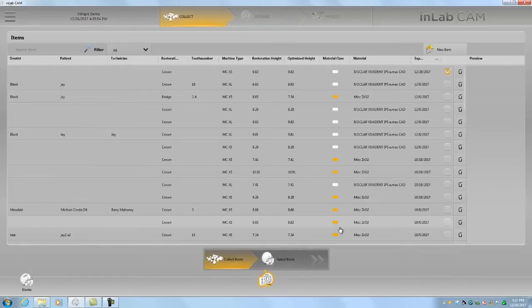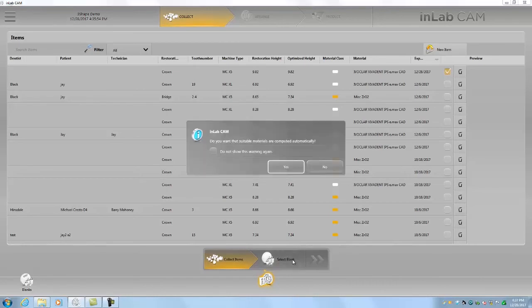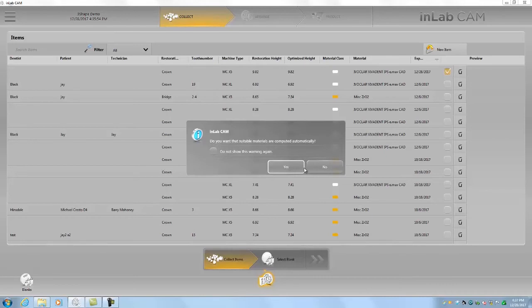Okay so we've collected all of our items, we can move to the next step of selecting the blank. Make sure that suitable materials are computed automatically. Let's say no here.